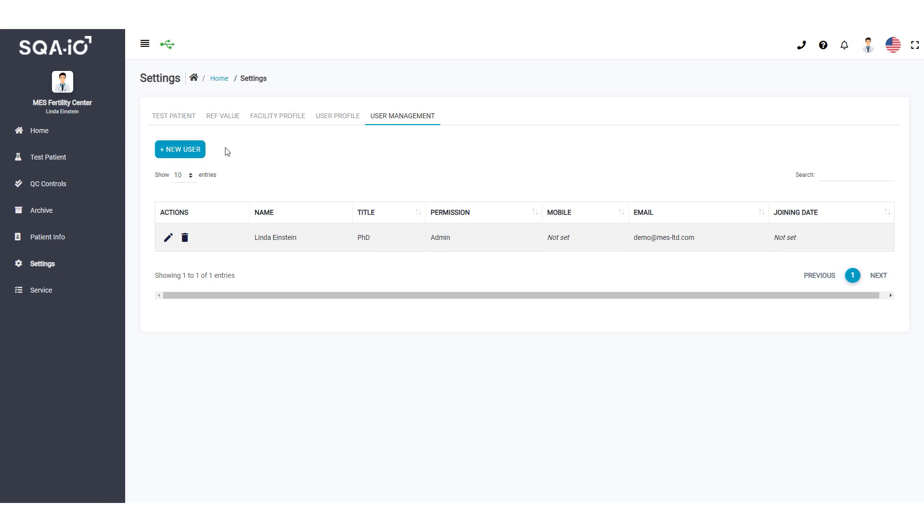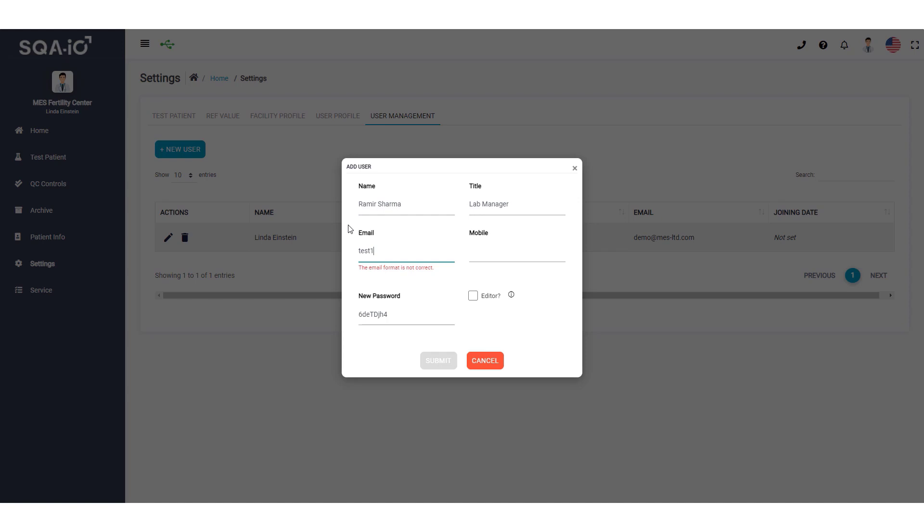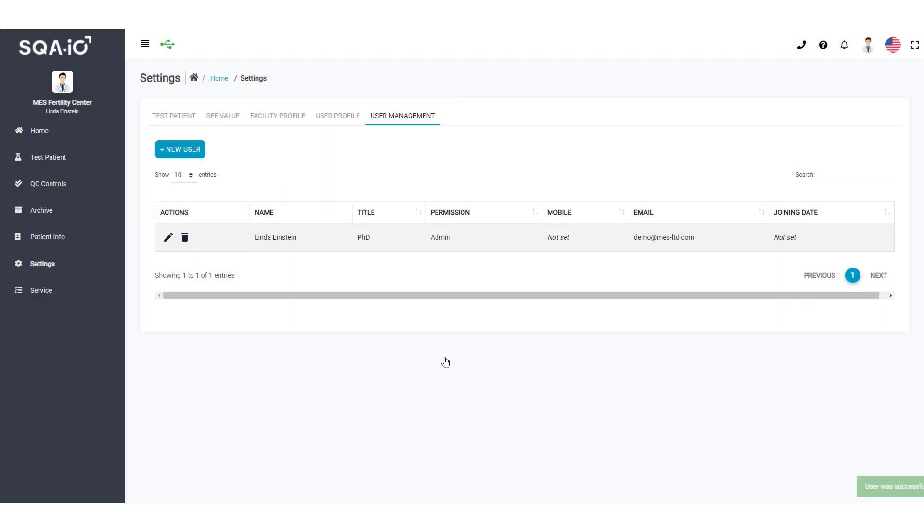Click this button to create a new SQA-IO user. Enter the username, title, email, and phone number. A temporary password will automatically be assigned to the new user, and they can now log in to the SQA-IO using their email and temporary password.